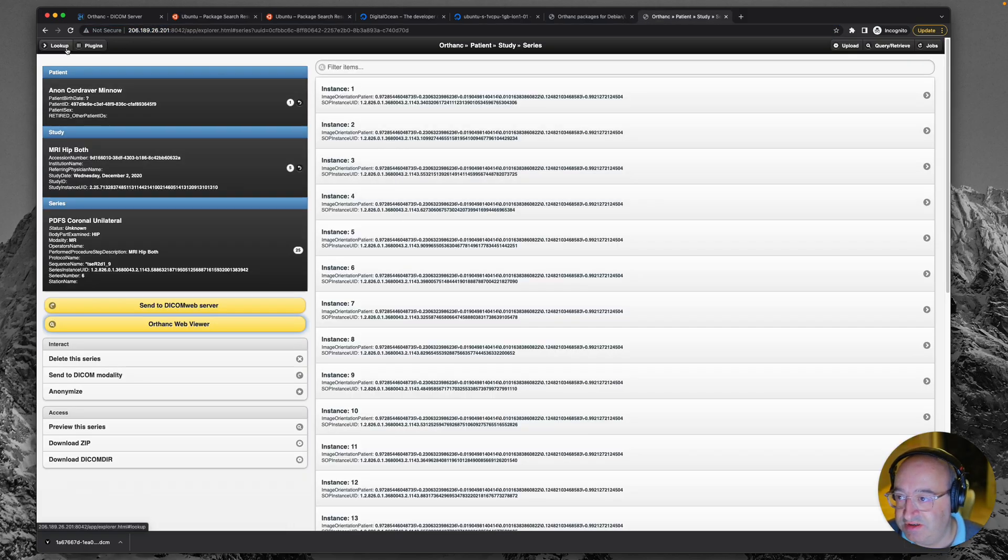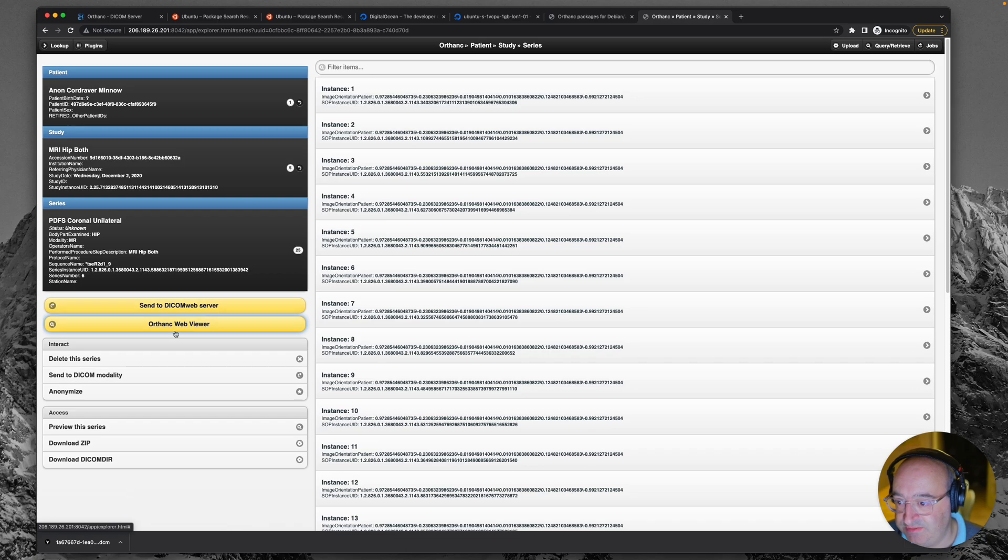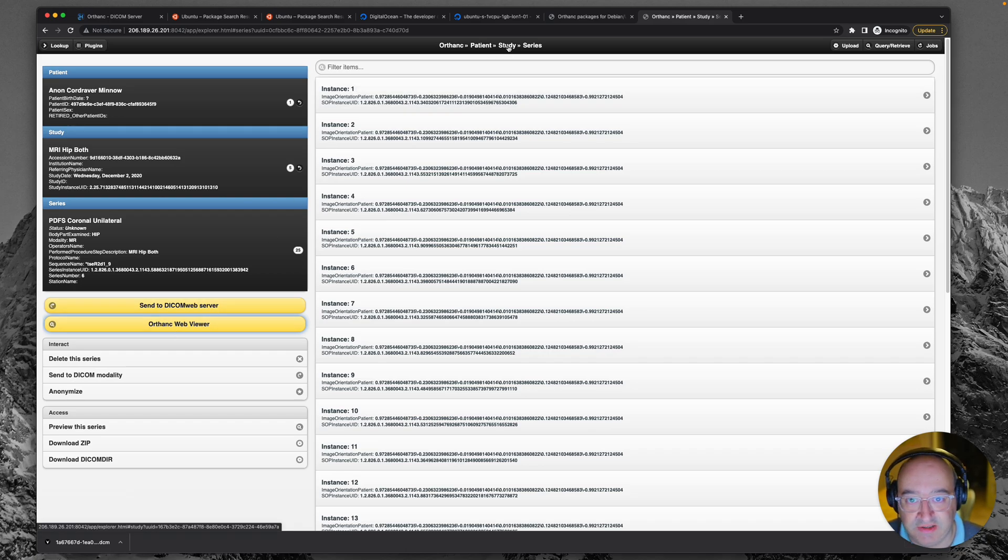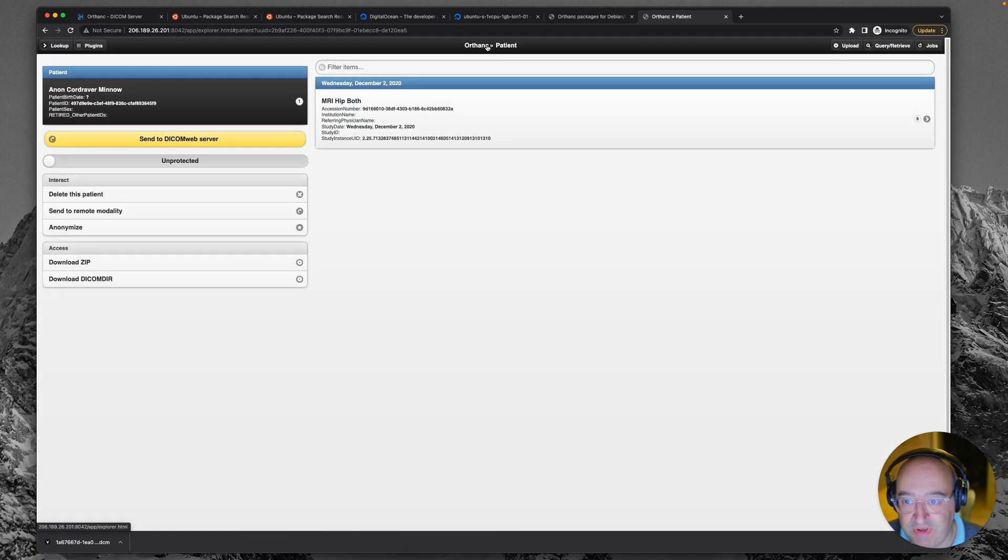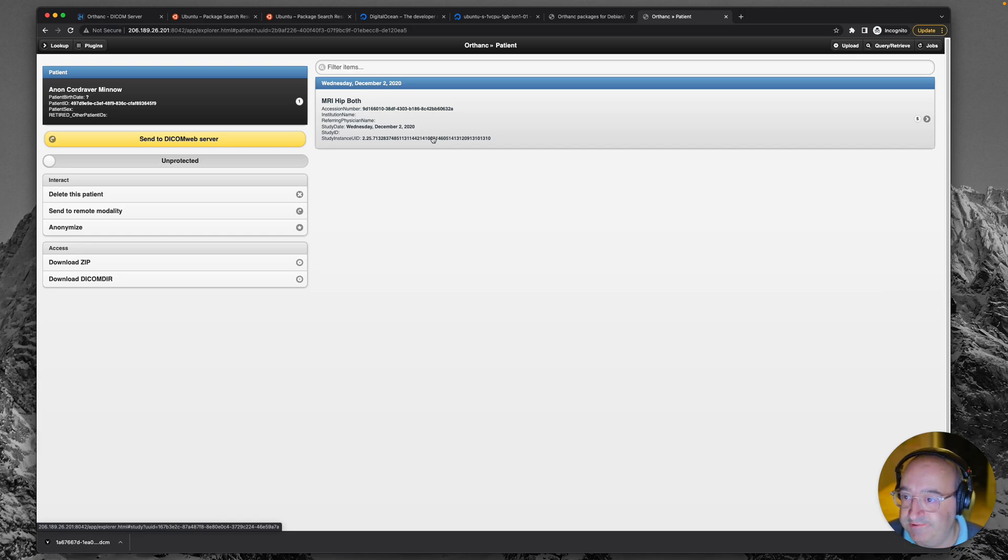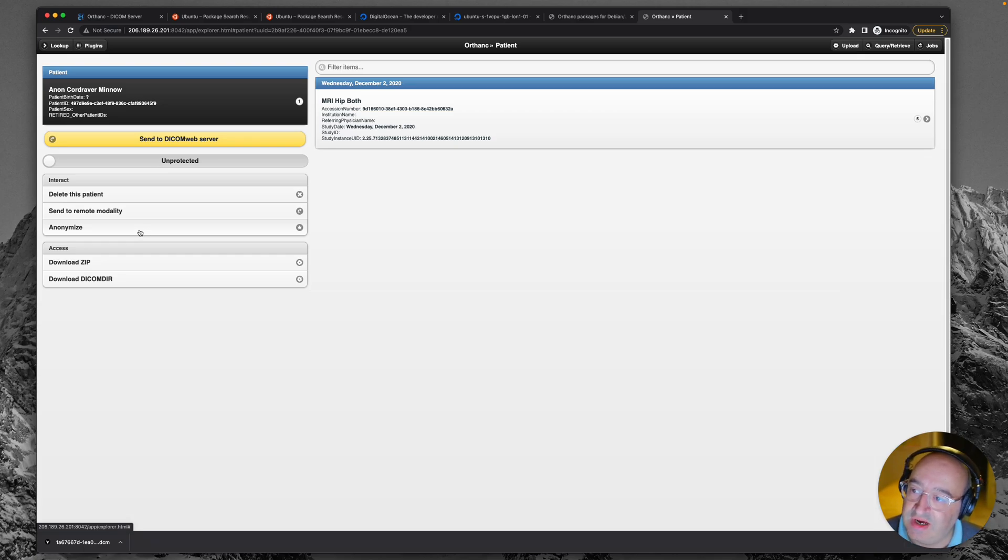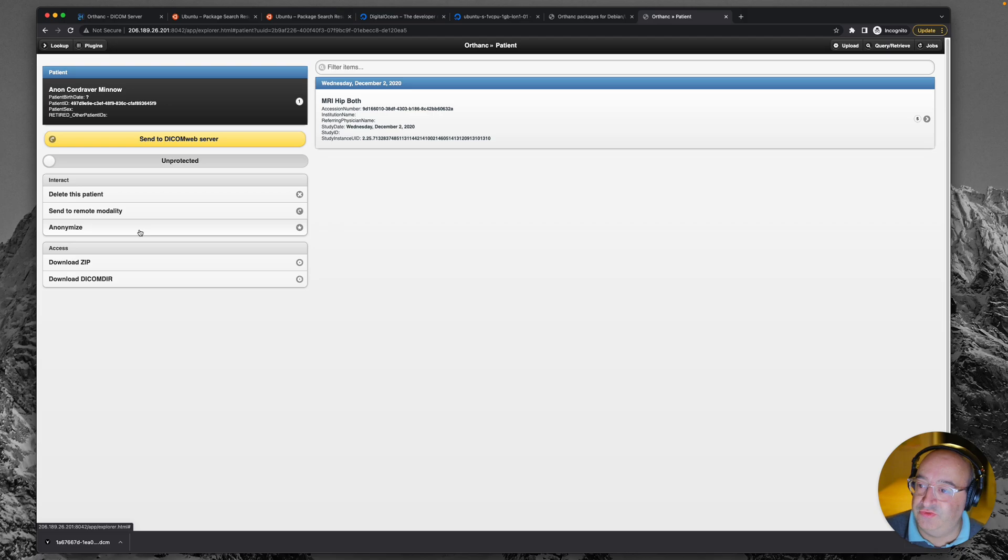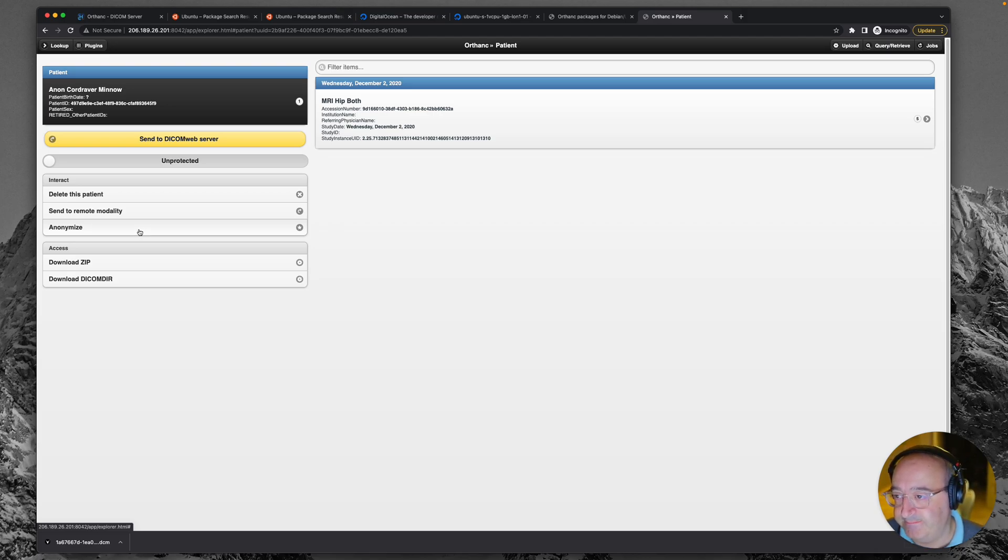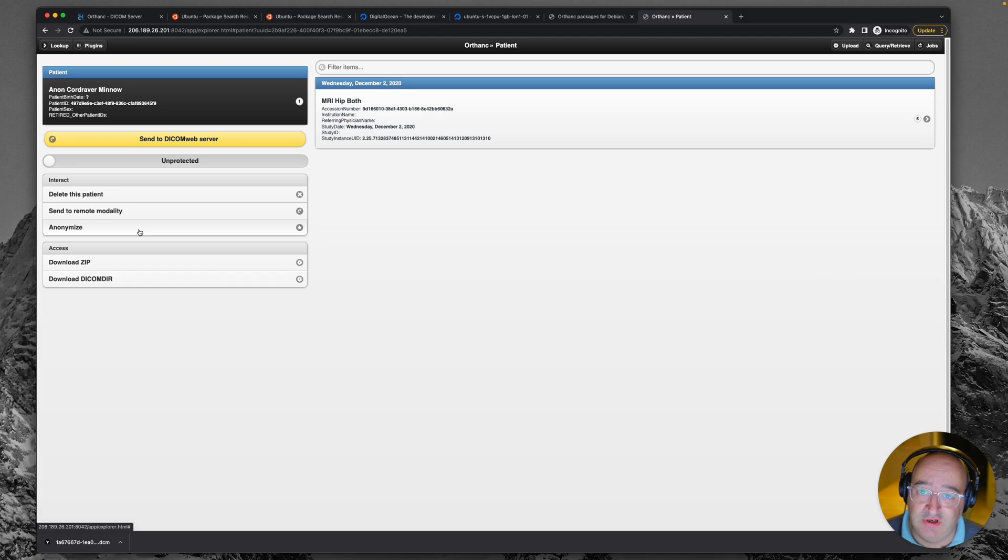I did also notice that there seemed to be a feature if I go back to patient. Yeah, look at this, anonymize. So actually the server will anonymize things for you. Although it's much better practice to anonymize them first before you send them up, of course.